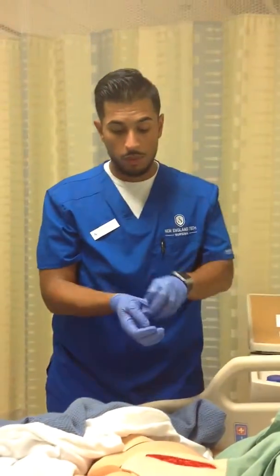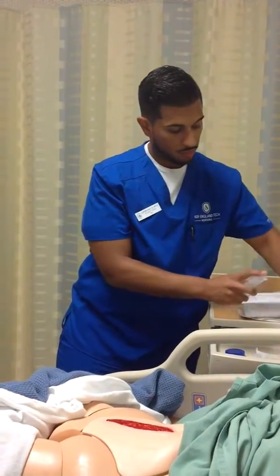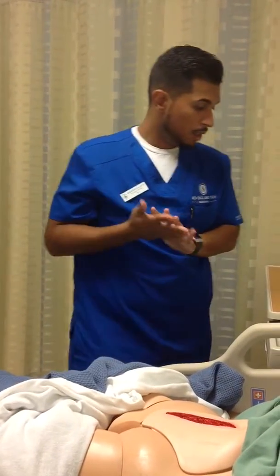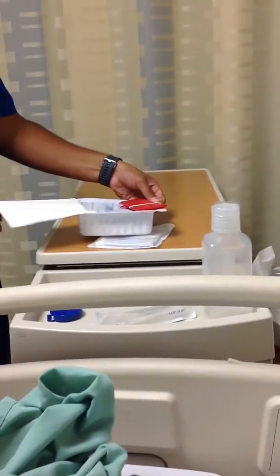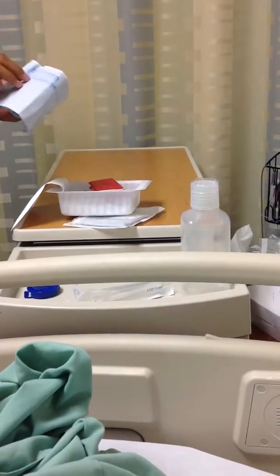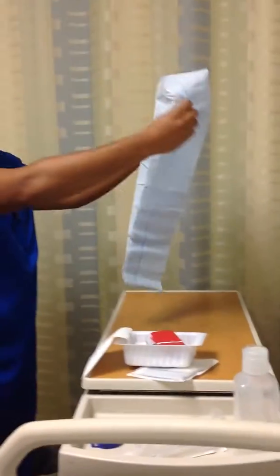At this point, I would remove my dirty gloves, perform hand hygiene. At this point, I want to start setting up my dressing change tray. So I would open the dressing change tray, and I would pick up the sterile field, making sure to pick up where it says pick up here on the sterile field. I would open the sterile field, not touching the inside of the sterile field.